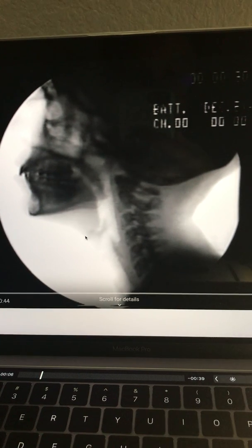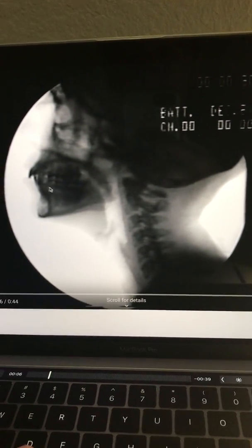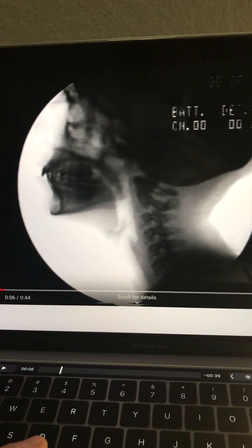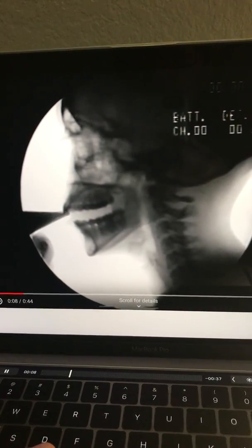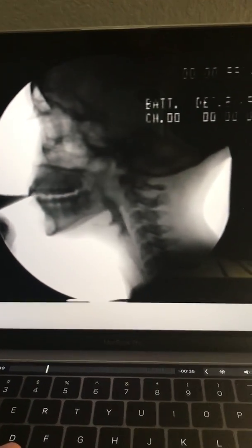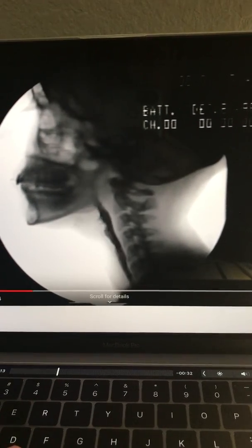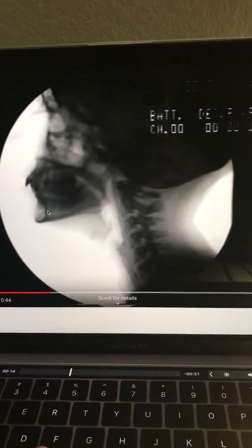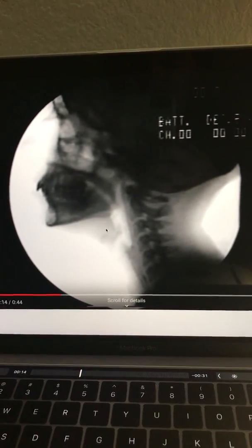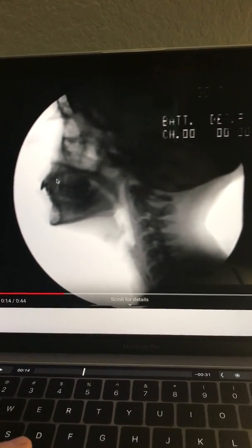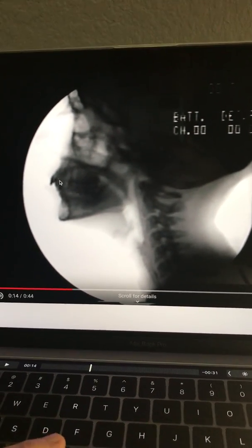Going through everything one more time — here is the hyoid bone. Here is the tongue, with the base of the tongue being here. And here are the teeth, with a bolus in the mouth right now.